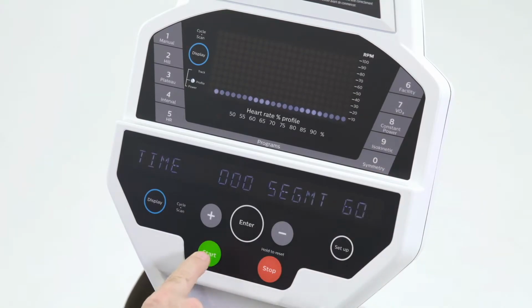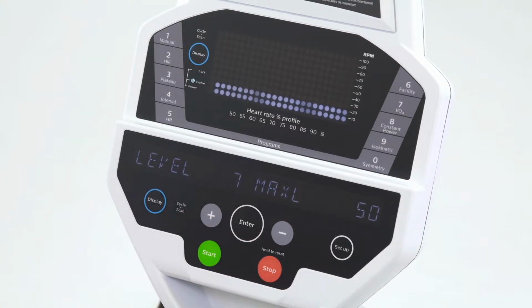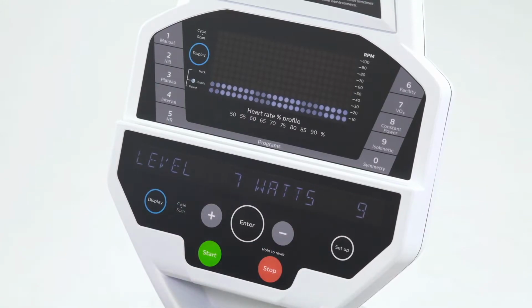If we just press start from the beginning as a quick start, the resistance mode we get is a constant resistance, which means the resistance level is set at a constant rate, and the power will be determined by how fast the patient pedals. So the faster they pedal, the more watts they would do.